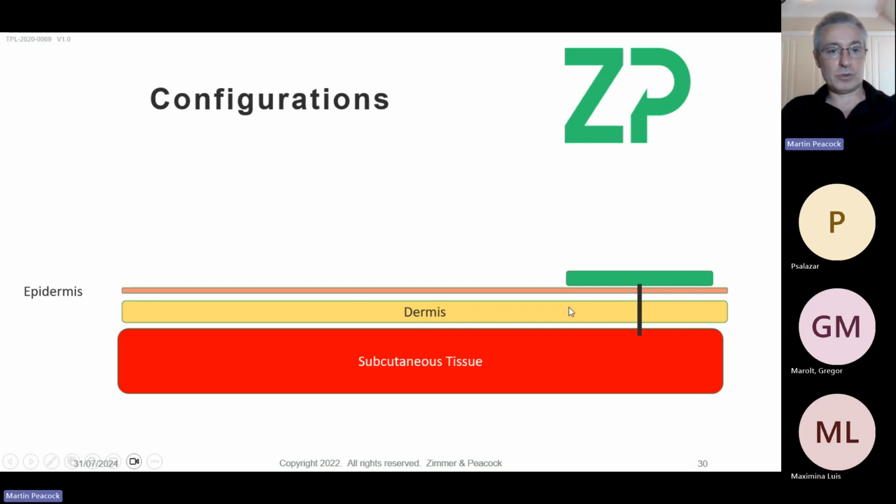Now I can see what Abbott's doing here. They've got a very sticky patch here. So this surface area is sticky, and it's all about anchoring this sensor to the skin, because they don't want it moving around because of the movement artifacts we talked about. They have this big sticky patch that helps anchor the sensor in place. So that's the state of the art today.